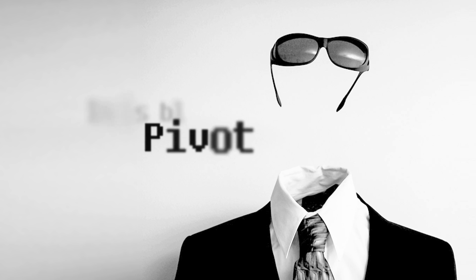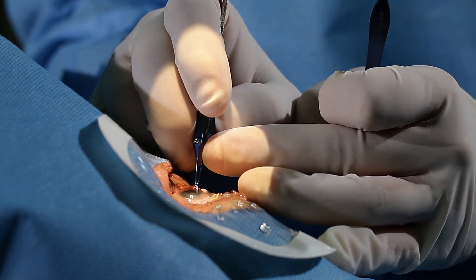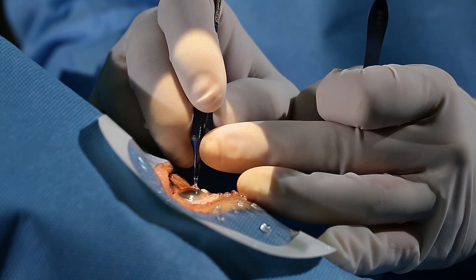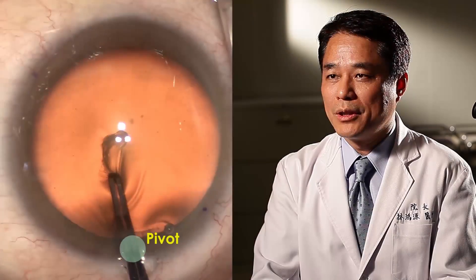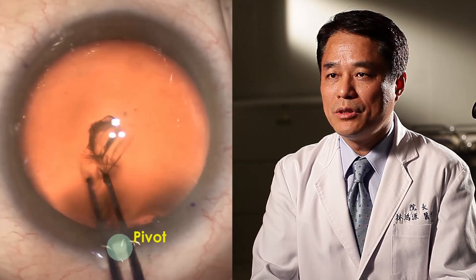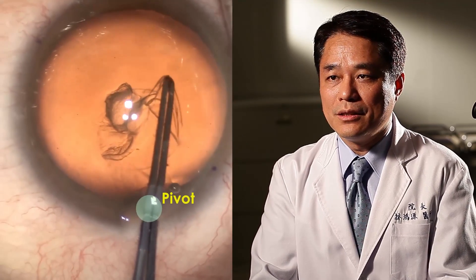Invisible Pivot. Cataract surgeons should be familiar with the technique of continuous curvilinear capsulorrhexis. However, learning to achieve an adequate capsulorrhexis through the smaller clear corneal incision can be a challenge. The devil is in the details and the technique is about the concept of pivot. In order to build this concept, we must imagine an invisible pivot point at the center of the clear corneal wound.